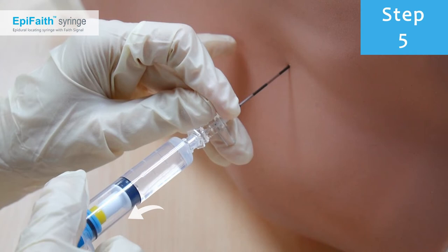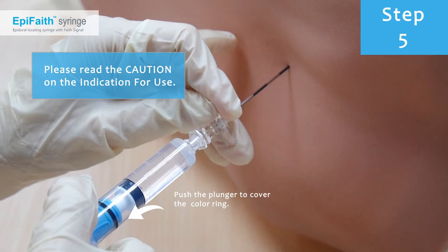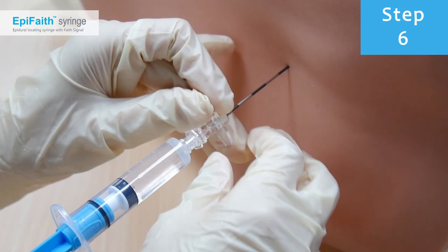Push the plunger to increase pressure and cover the collar ring. Note: the harder you push, the higher the pressure. If the collar ring cannot be covered after pushing the plunger, check the needle tip position.